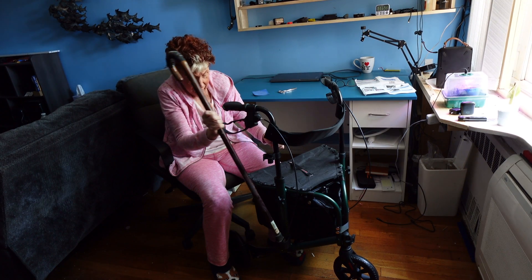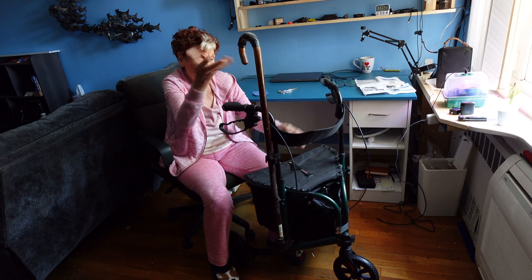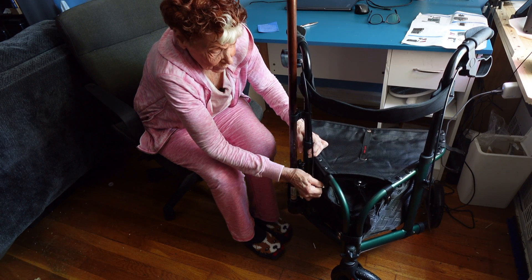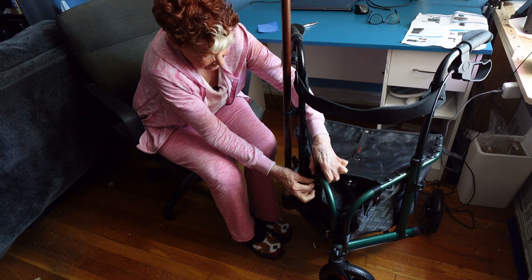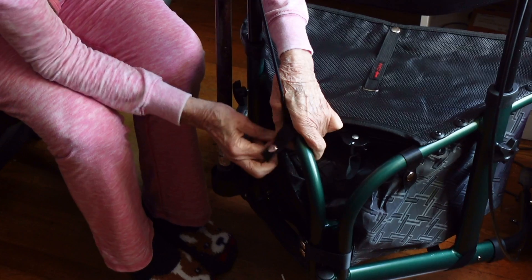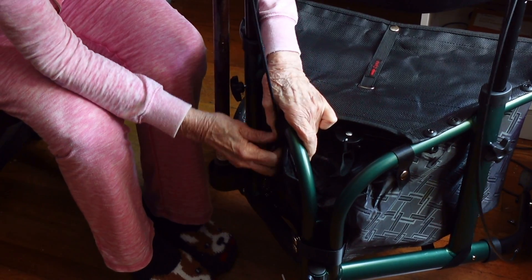This is how we put our cane in — put it on the bottom, snap it right in on top, and voila. Now we're going to secure the brake cables so that when you're walking in a store or wherever, they don't grab onto anything nearby. We take this flap and just put the brake cable behind it and snap it right in.